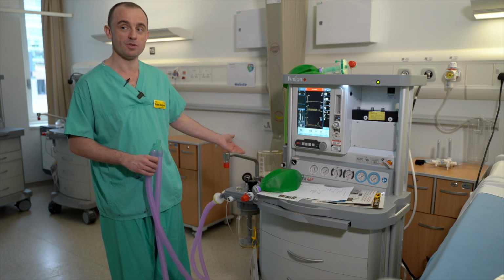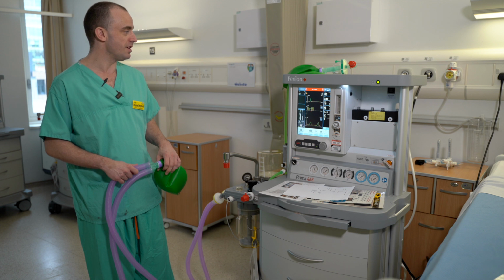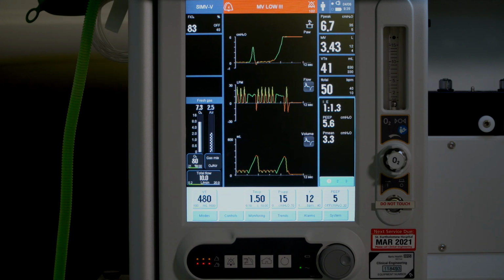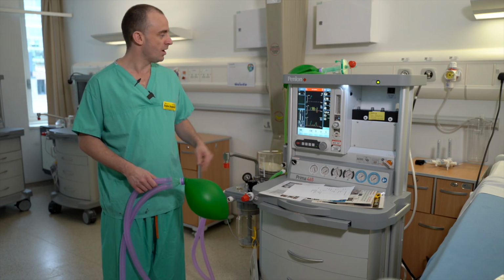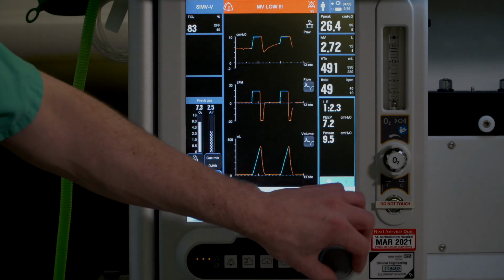And here you can also see what happens if you have a leak. Your bellows will collapse. When you reconnect or you deal with the leak, the bellows will refill, but it will take time. And you'll see that even at a gas flow of 10, it takes 20 or 30 seconds for that to happen. One way that you can reduce that time is by temporarily increasing the gas flow.